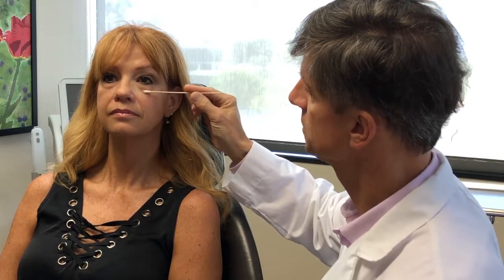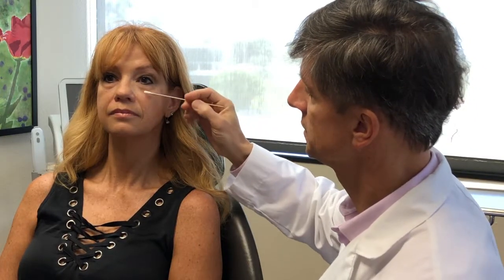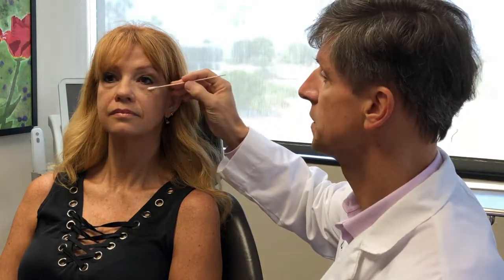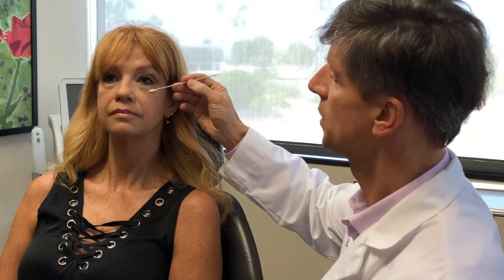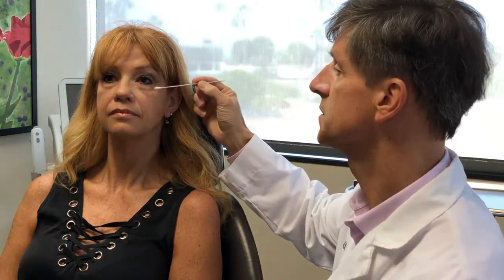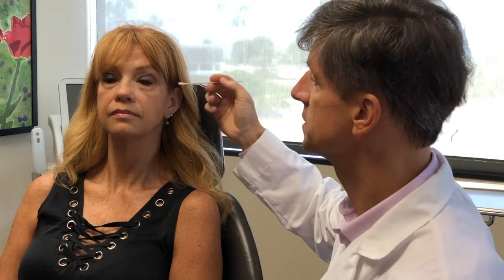We want to come just up to the nasal jugal groove here, or the beginnings of the tear trough, but we have to avoid any hyaluronic acid in this area because the superficial lymphatic system is already full. If you put hyaluronic acid into that space, it will absorb water and you will iatrogenically create edema and the malar mound in this area.